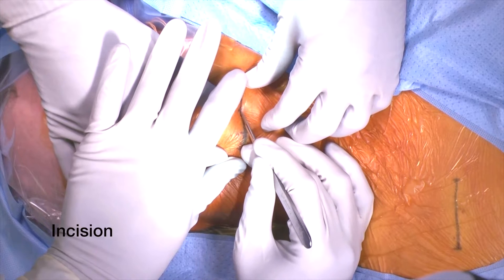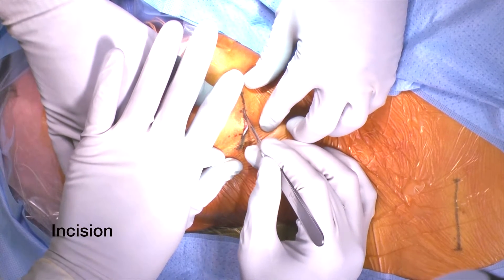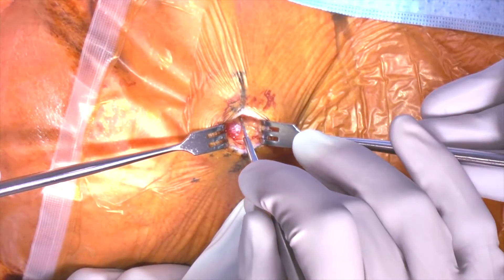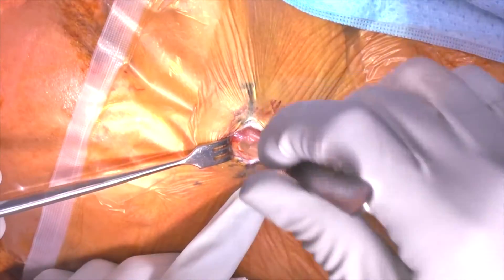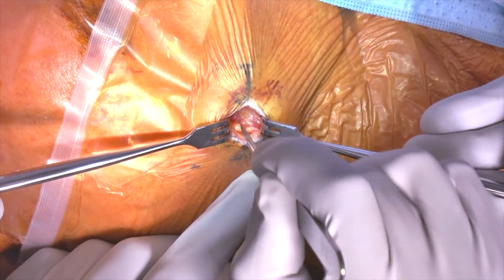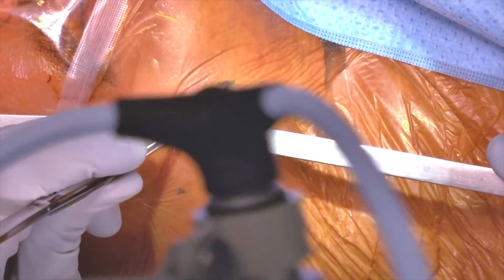You can see the larger incision marked out, which we do not use. We only limit it to our two centimeter incision. The incision goes through the skin and then through the platysma. We're very careful not to cheat on our incision — we want to keep this small for the patient. Once we get through the platysma, we will dissect down with our landmarks being the hyoid bone.